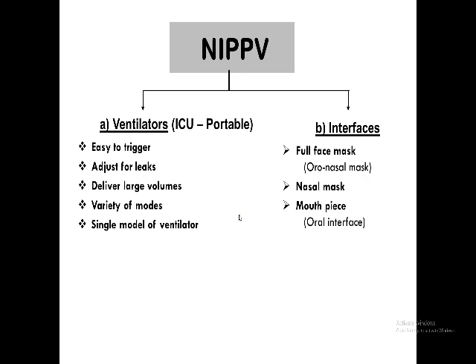And how will I apply it to the patient? I use specific masks, not the ordinary face mask or nasal cannula. I need specific masks for non-invasive ventilation, which are full face mask, oronasal mask, mouthpiece mask, or oral interface.